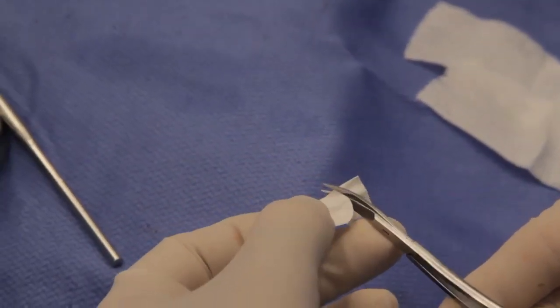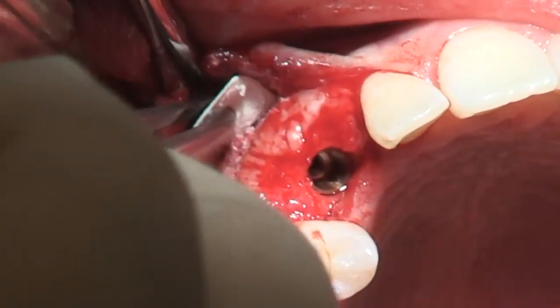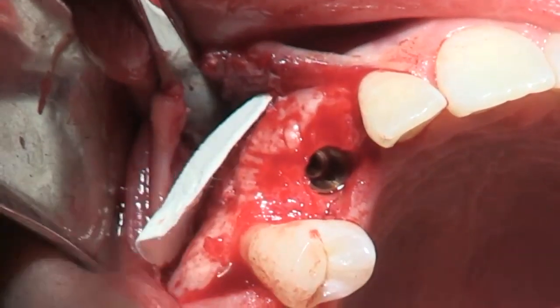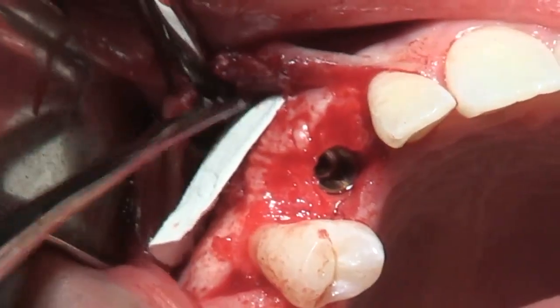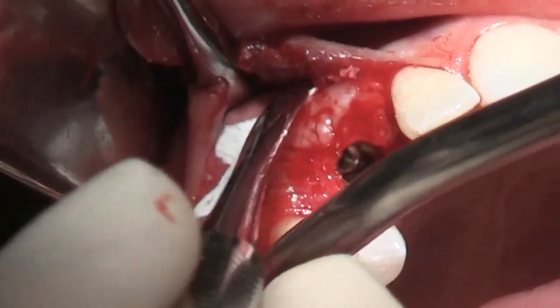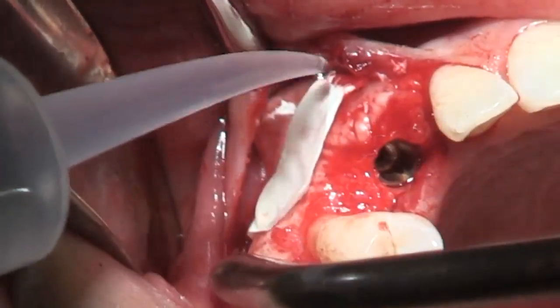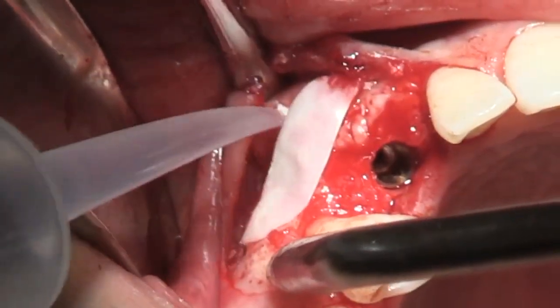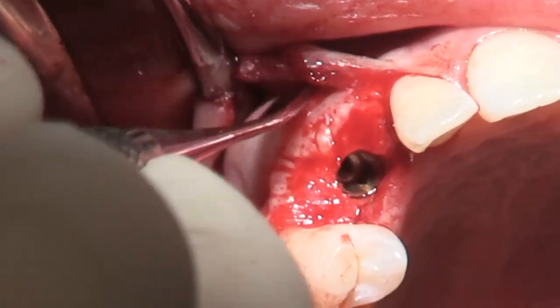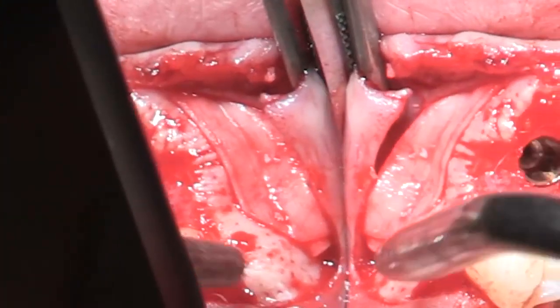This naturally cross-linked collagen membrane allows good stabilization in a moderate defect like this, just with hydration of sterile water. Here, gentle pressure is being applied to place it under the flaps of this site.